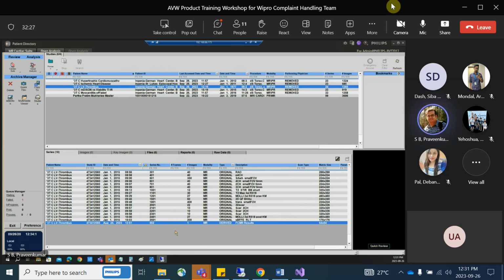This is application specific. These raw images are in the PACS. Now some application will input the raw images into the ISP. Once the images are in the ISP, my objective is to see the images through MR perfusion or MR diffusion. Now you tell me what pre-processing will happen in that case.